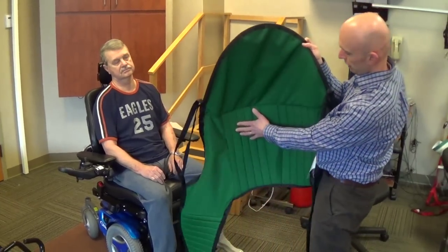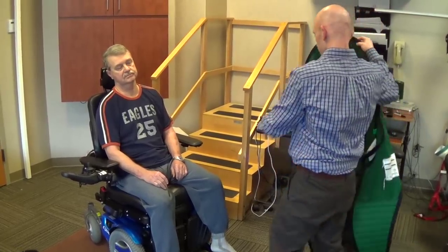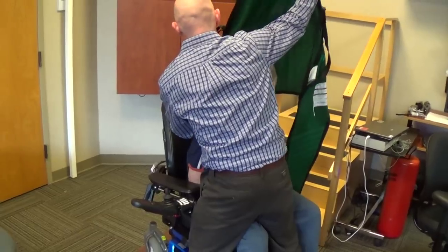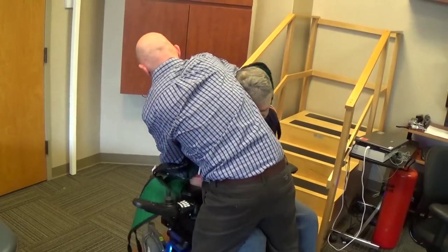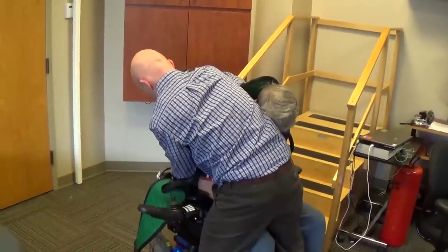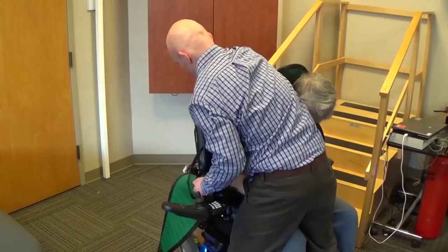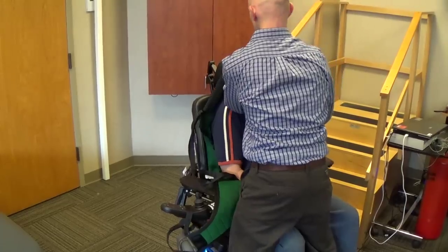I'm going to put the sling in with the handle on the outside or the back. I'm going to help the person lean forward, staying close to your body, and then sliding the sling back behind them. You want the bottom part of the sling close to the person's pelvis, so sliding down low, almost towards the cushion, and then helping the person rest back on the seat, and then helping them get their head back.